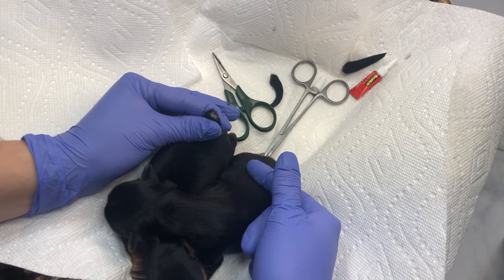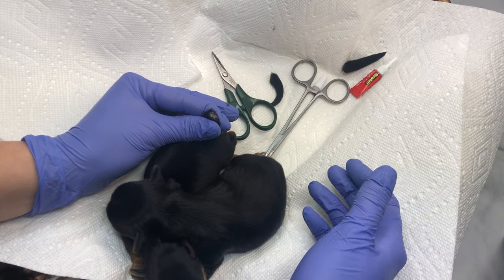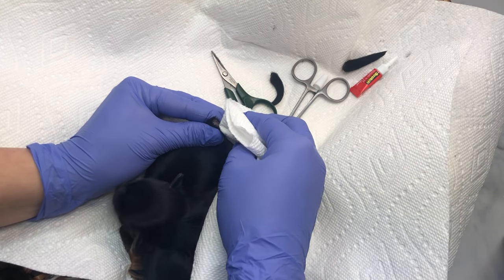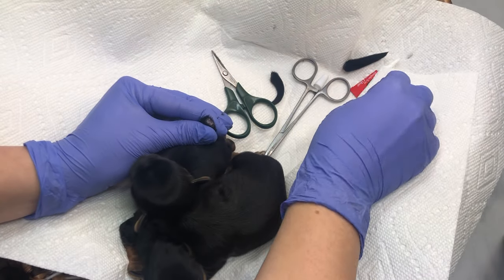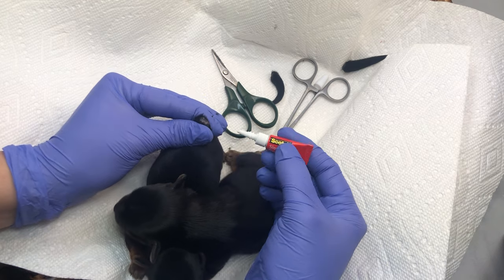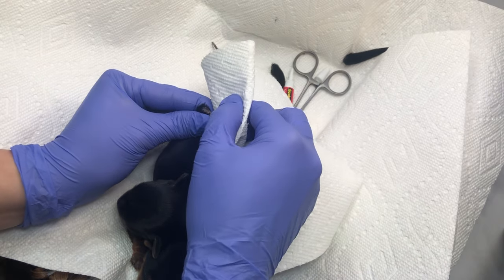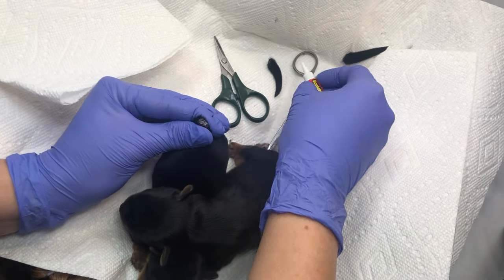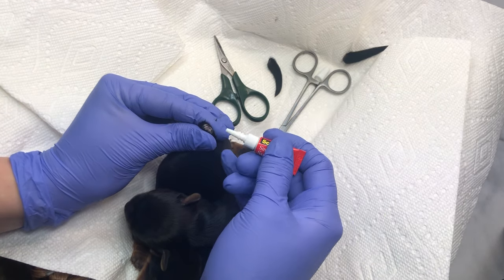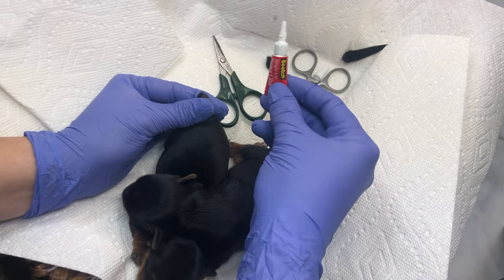I love doing these myself because I do worry about them picking something up at the veterinarian's office — like canine herpes virus, there's just so many things they can get. I see a little spot of blood right there, just a tiny little spot coming out, so I'm just going to dab another little bit of super glue. If you want it to harden faster, you can kind of tap it, but we just want them to be as comfortable as possible.